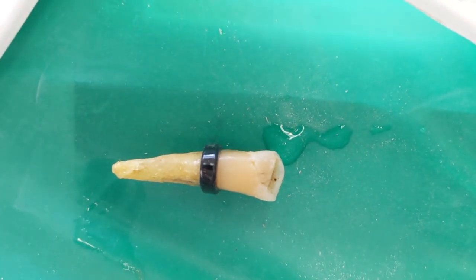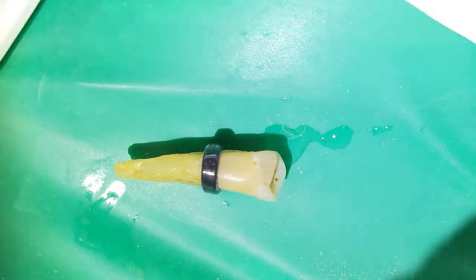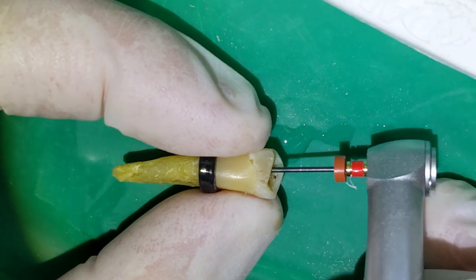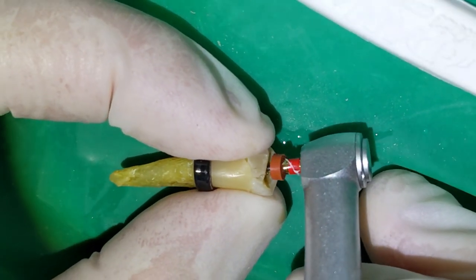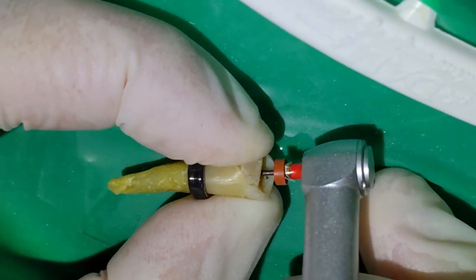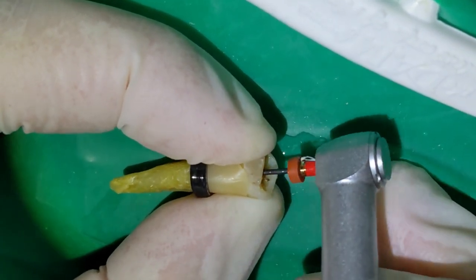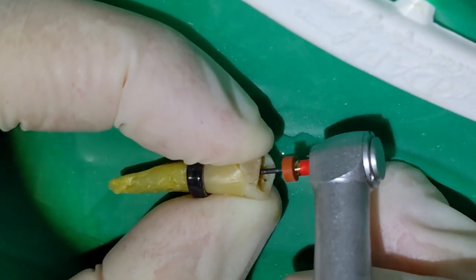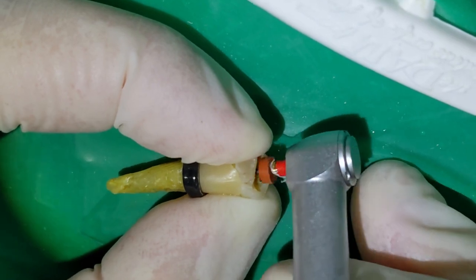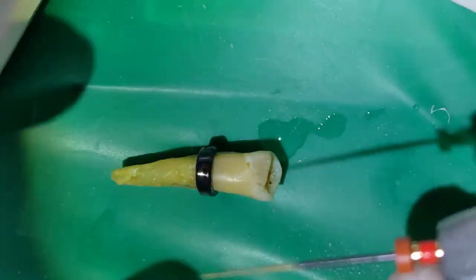All right. So we got number 20 to length. Let's go to number 25 again. And then the size file that you end up with kind of depends on the shape and size of the tooth. This is number 25. Unless it's a really tiny tooth, I like to take it at least up to a size number 30. So that'd be the next one after this.